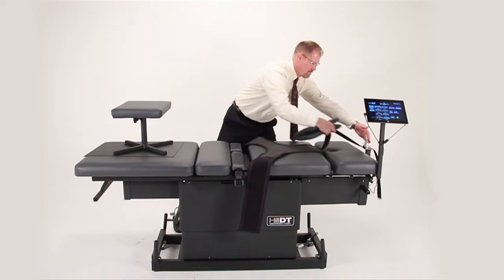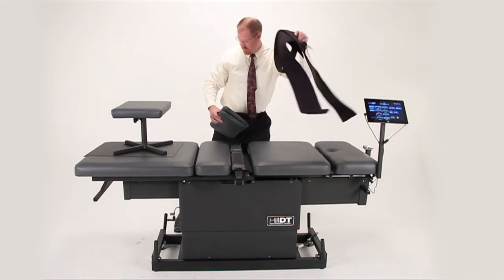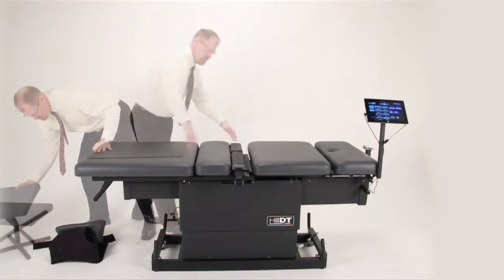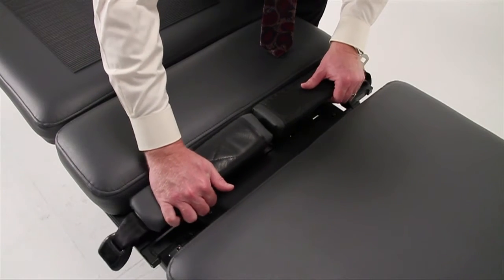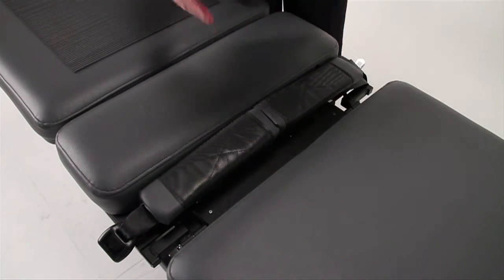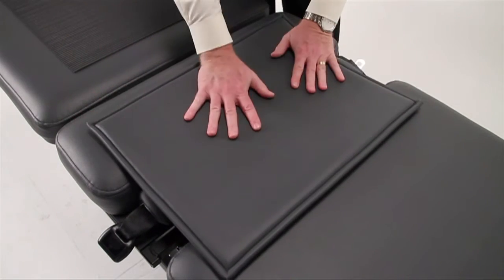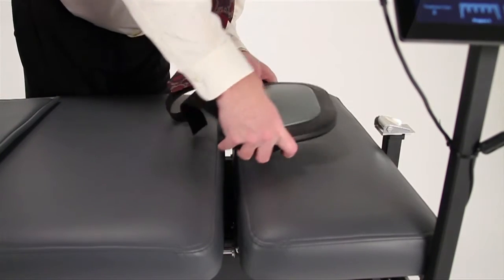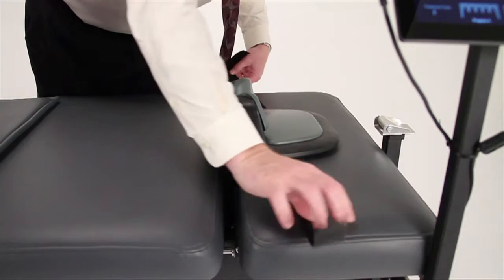Switching to cervical decompression is easy. Remove the pillow and the thoracic capture from the tabletop along with the footstool. Close the pelvic capture cushions completely to create a firm surface under the patient, and then place the pad over the top. Place the cervical capture into the aperture in the head cushion and spread the straps over to the sides.